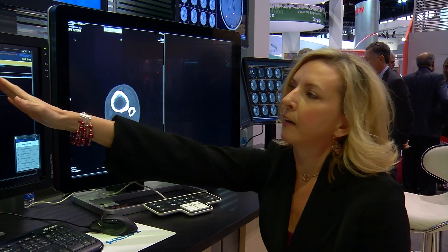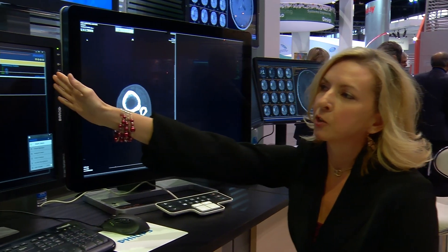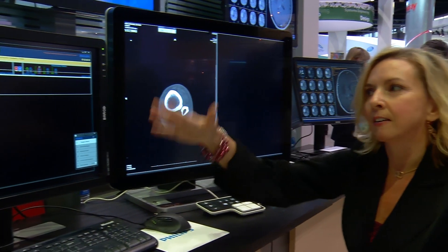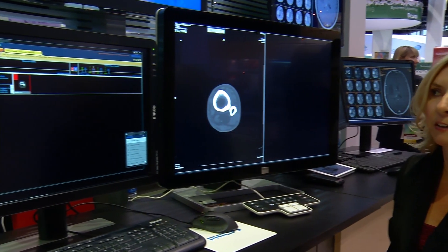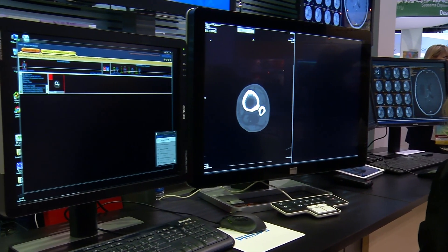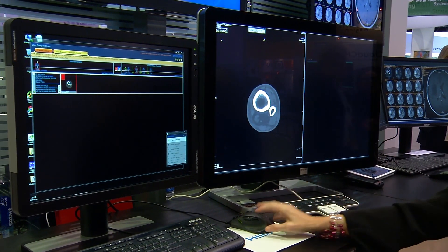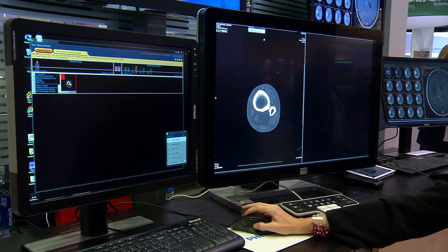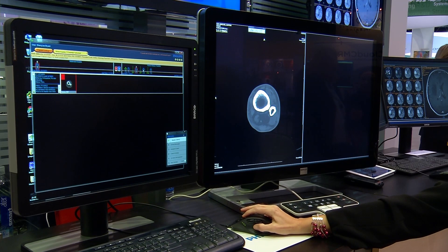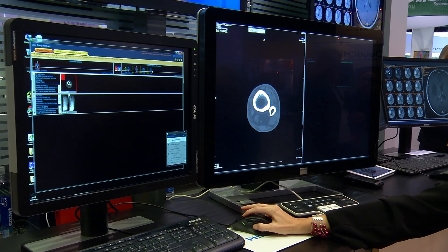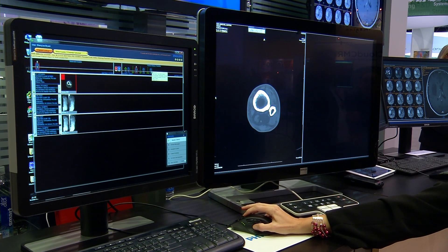We have a patient history timeline that reveals the entire patient history, and you can simply click on these studies to reveal even more history of the patient.